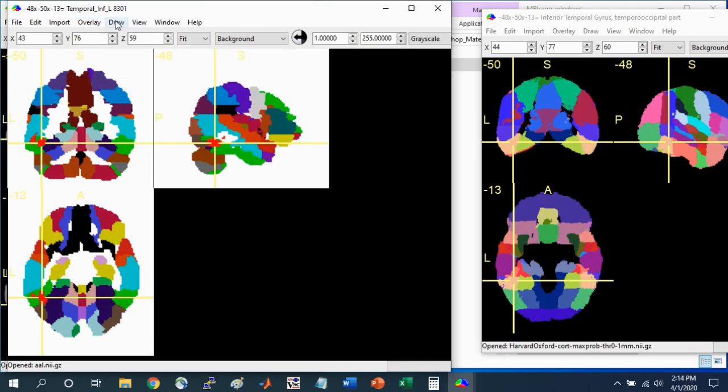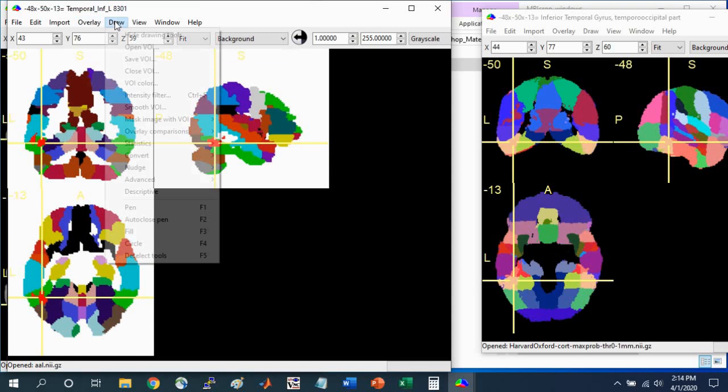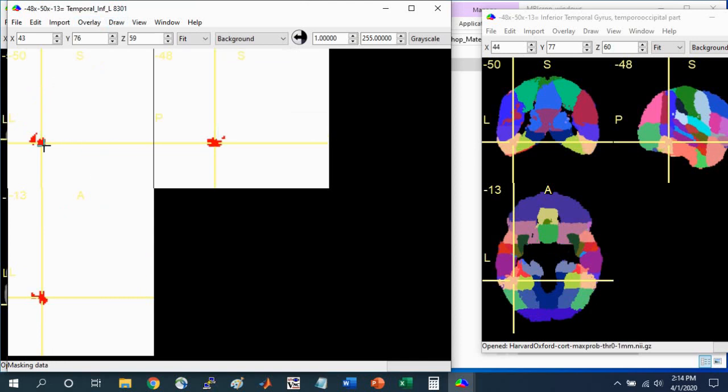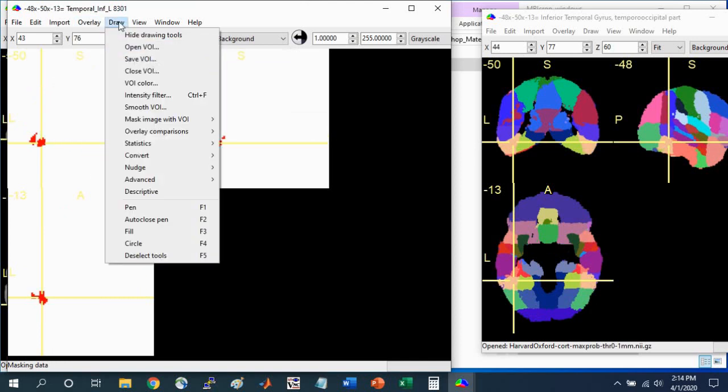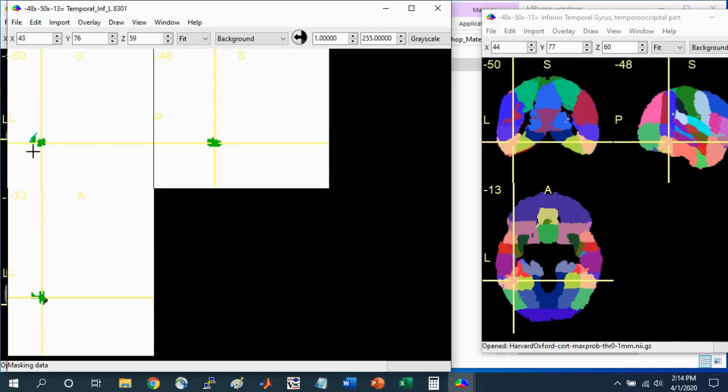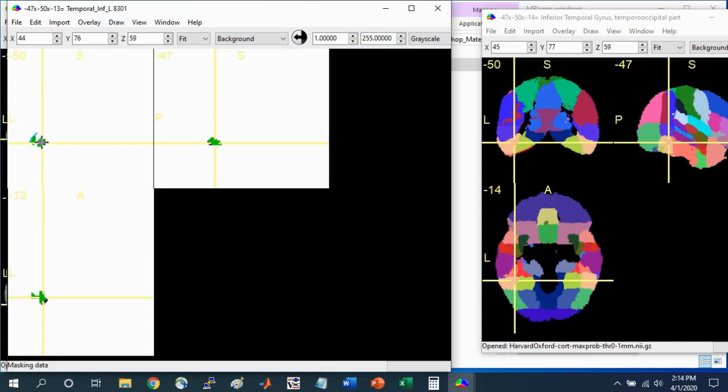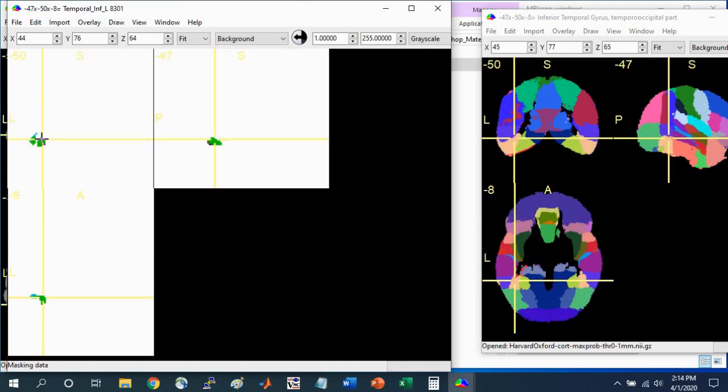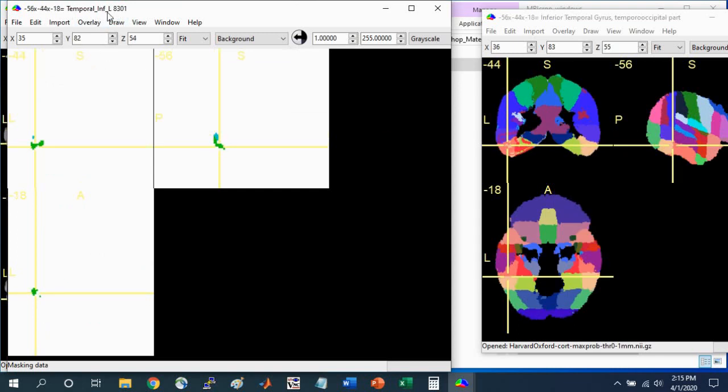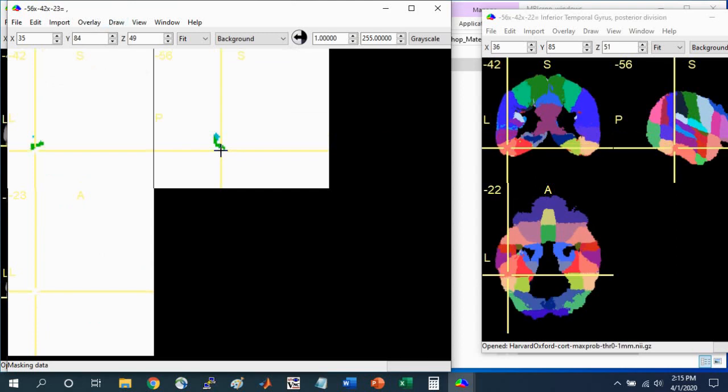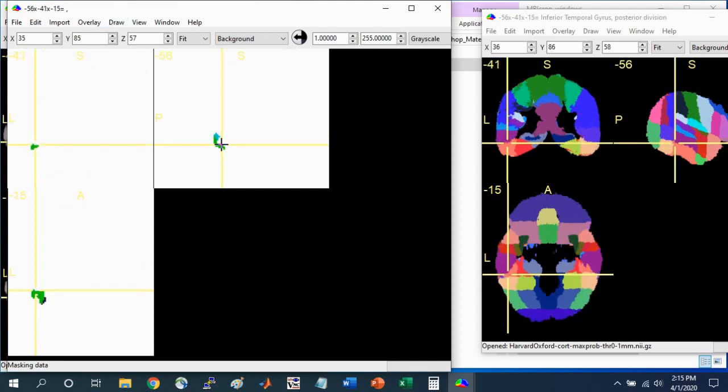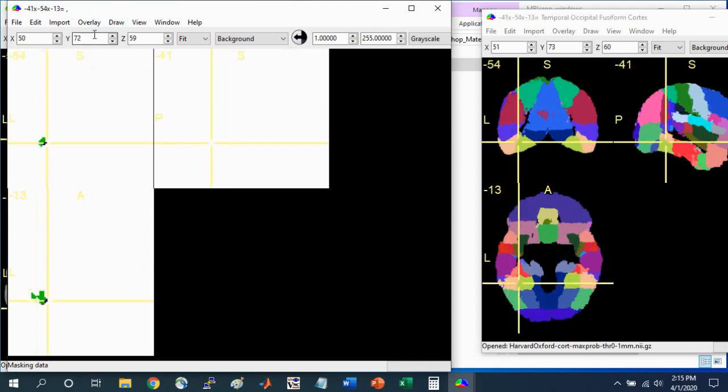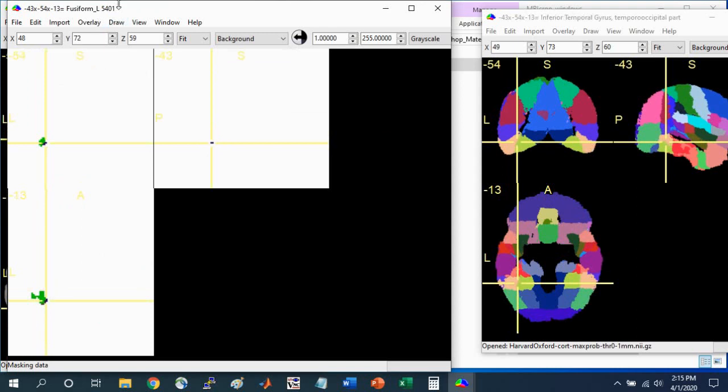What you can do is go to Draw, Mask Image with VOI, and Preserve regions within VOI to get rid of all other parts of the brain. Now when you go to Draw, Close VOI, what you see is only the brain regions associated with your particular cluster. You can click around on these different colors to identify the left middle temporal gyrus, the left inferior temporal gyrus, and a little bit here in the black of the left fusiform.